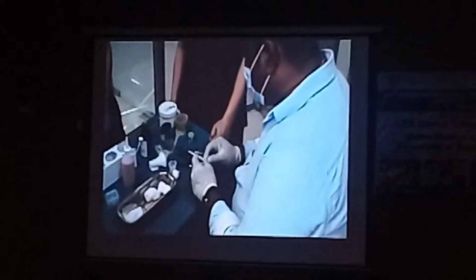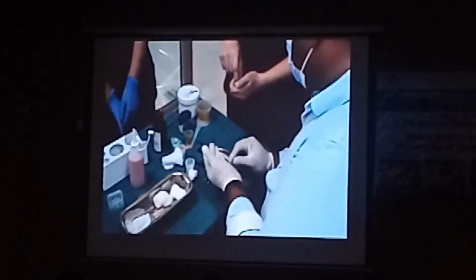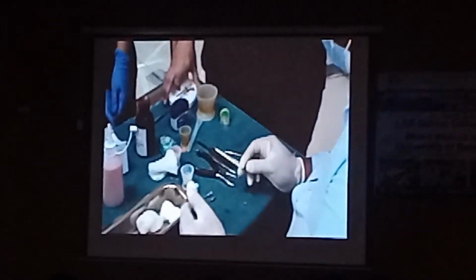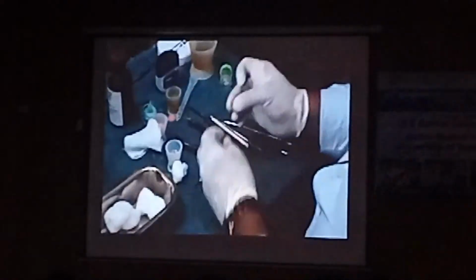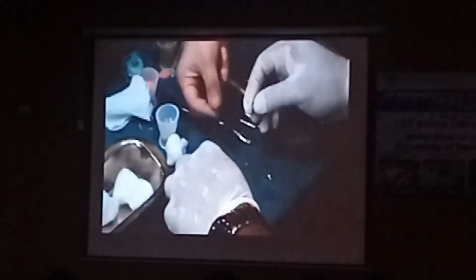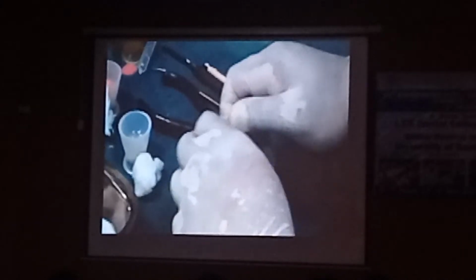Another thing that one of you asked me was how to make a customized healing cap. Do we have an analog? So imagine I have to customize this healing cap. But it's very difficult to hold it like this and do it, right? So I'll use an analog and tighten it to the analog. So I can hold the analog now and I easily work.